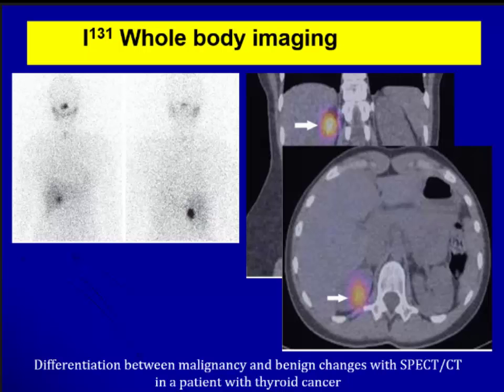Another example shows star artifact and excreted activity with a focal area. In my experience, with I-131 you often see activity within the pelvis — particularly at the midline — which on SPECT-CT is most often activity stationed within the rectum. The sigmoid colon wraps around and reflects back as the rectum, and this creates focal activity that would otherwise be reported as being in the sacrum or posterior pelvis.